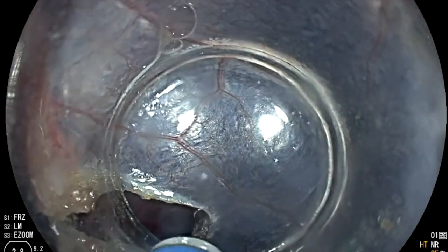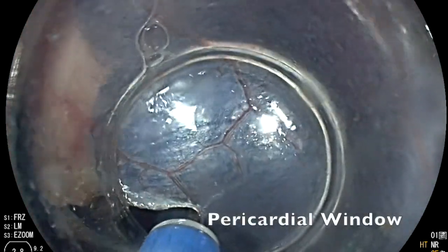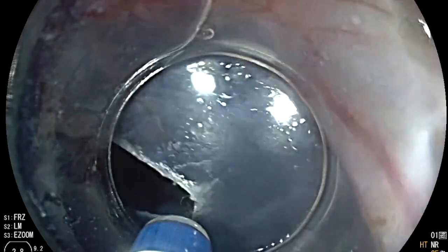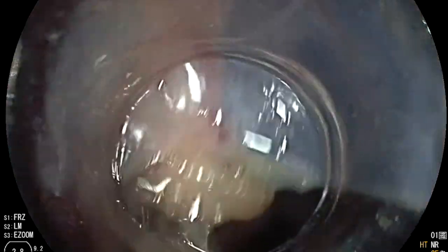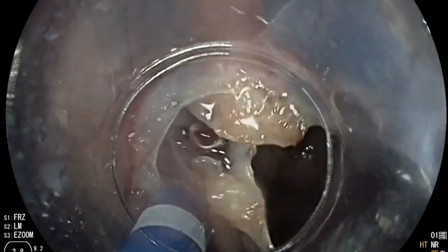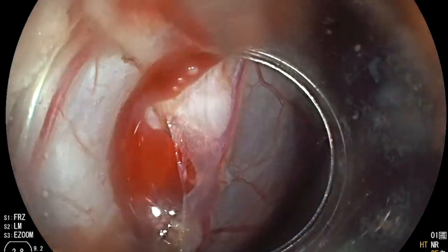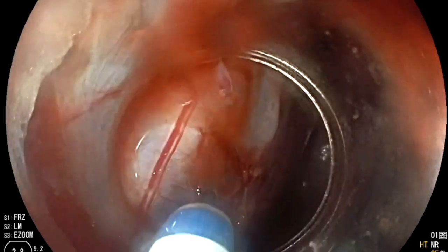We then performed a pericardial window, opening the pericardium into the left pleura with a ProKnife to allow for communication between the pericardial space and pleural space, which facilitates drainage of pericardial effusions. This is easily accomplished in the same surgical space.